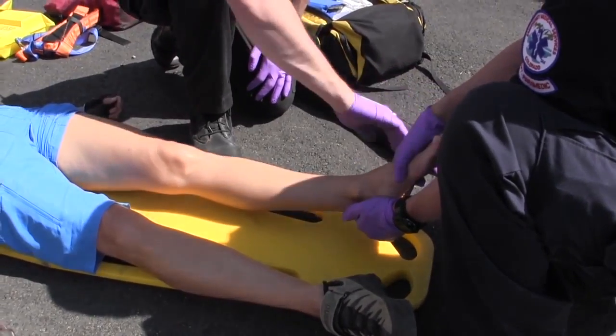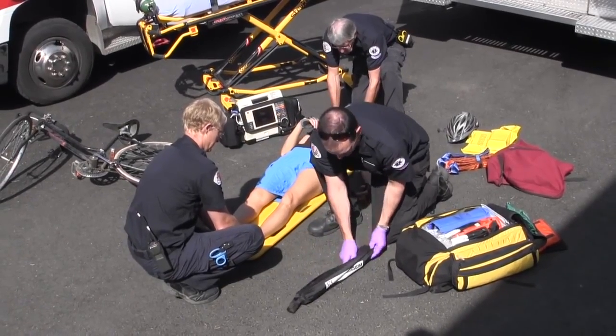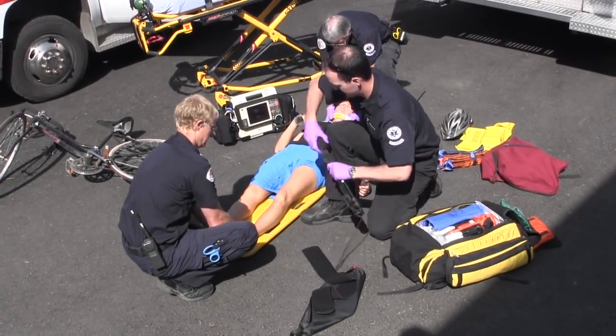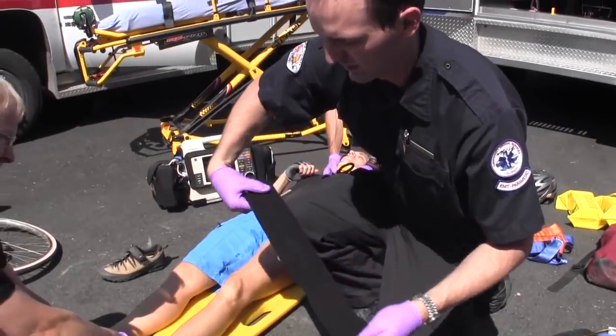The patient's circulatory, sensory, and motor responses are assessed prior to application. The first component applied to the patient is the ankle strap. It's removed from the pole, unrolled, then wrapped comfortably around the patient's ankle. The ankle strap is held securely in place by a large Velcro attachment area.